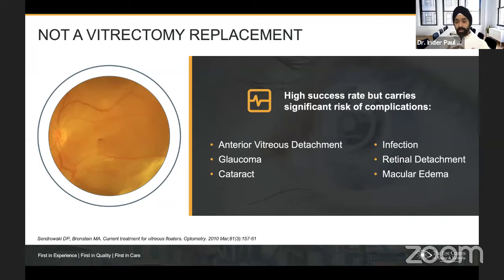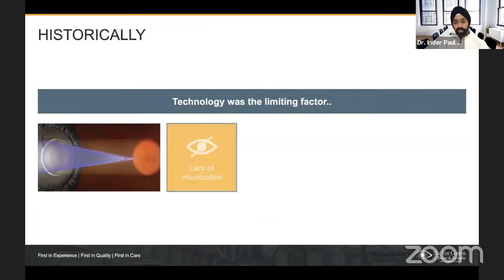As a glaucoma specialist, I can tell you, I do a lot of SLT and a lot of MIGS, the microinvasive glaucoma surgery, but yet I still do trabeculectomy, but not for everybody. I try the lasers first because of the safety profile, which we'll get to with this laser.